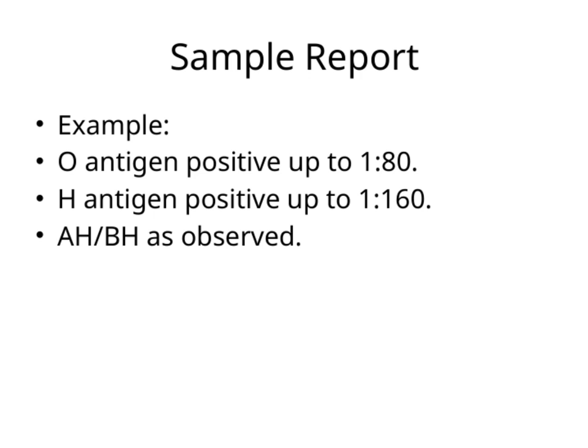Remember, the higher the titer, the more confident we are about the antigen's presence. Overall, these results help us pinpoint the exact strain and guide appropriate treatment or further testing. It's a key part of our diagnostic process, tying into the larger goal of accurately identifying and managing infections.